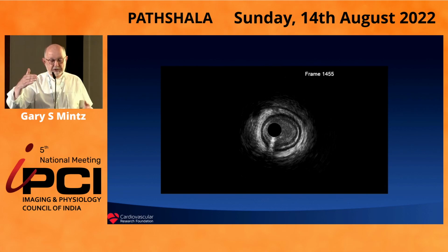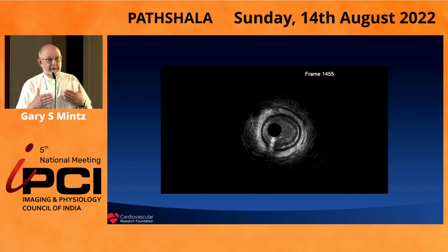Remember, she had an angiogram that looked like severe, smooth, tapering, three-vessel disease, and then she was grafted, the grafts closed, she comes back, there's no evidence of SCAD on the diagnostic, or on the IVUS study, but you see this.